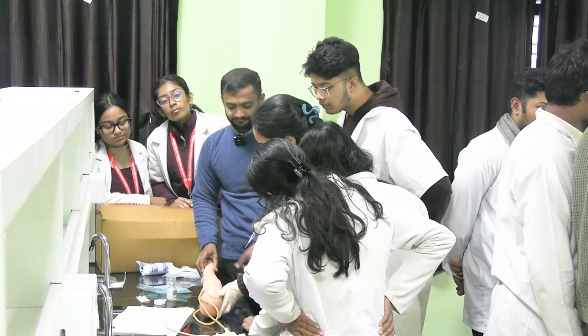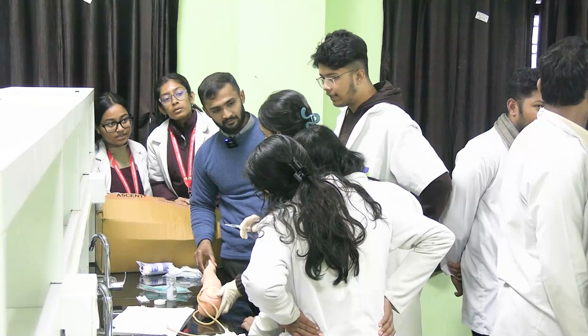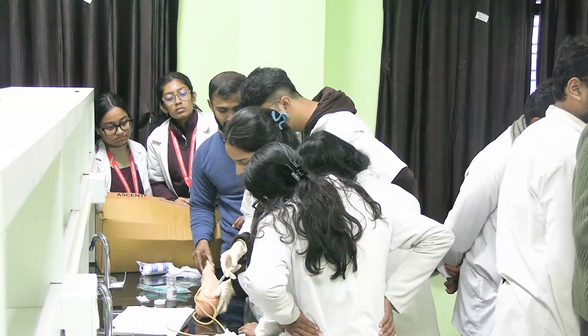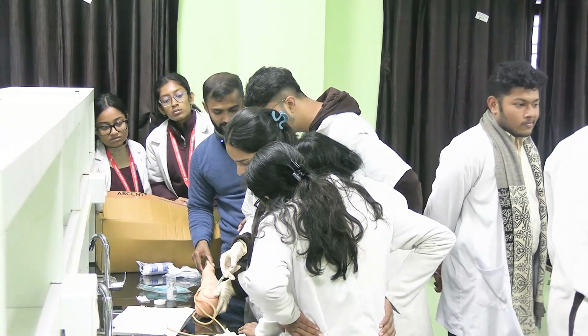Now what is the direction? For IM it is 90 degrees. What is 90 degrees? It should be directly perpendicular. It was a bit less, no? Two fingers less than that.